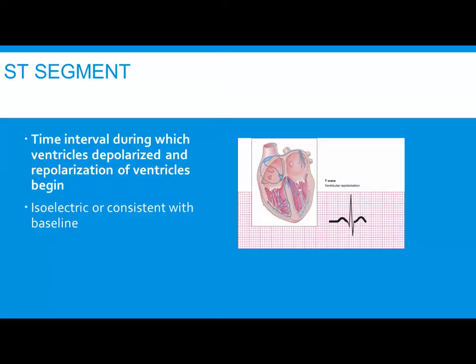What we look for in the future is going to be ST elevation or ST depression. So we may not be looking at time abnormalities with that, but we may be looking at voltage abnormalities with it, or amplitude. And here's the thing. If I've got a QRS complex and I start seeing a slower depolarization to repolarization right there, that means it's taking my heart longer to get back to its resting state, and it's telling me that my heart is having a hard time, and I may have some ischemia in the cells. Okay?